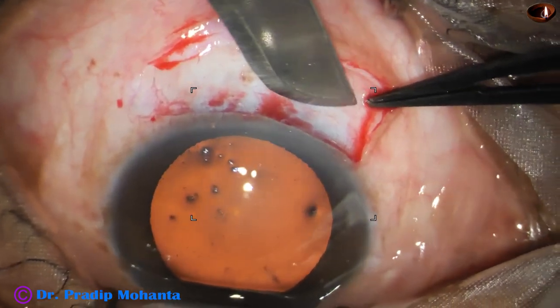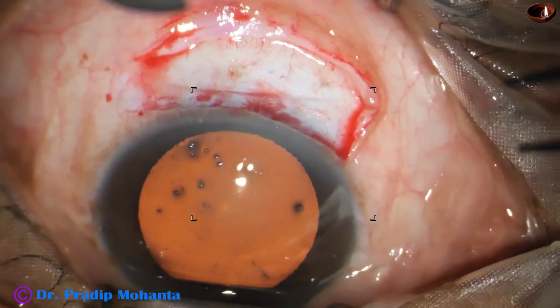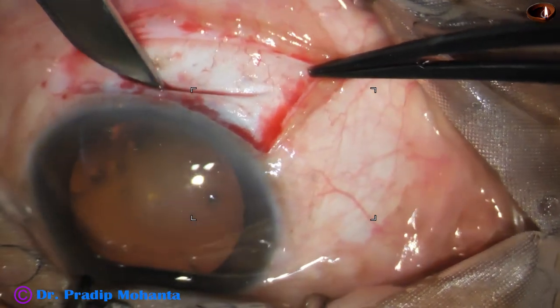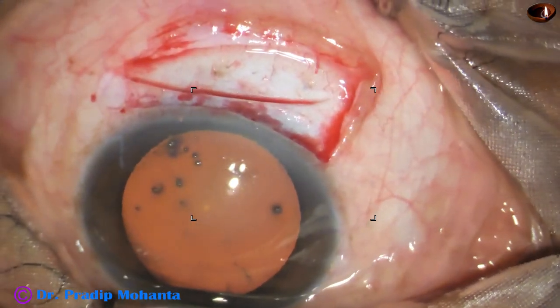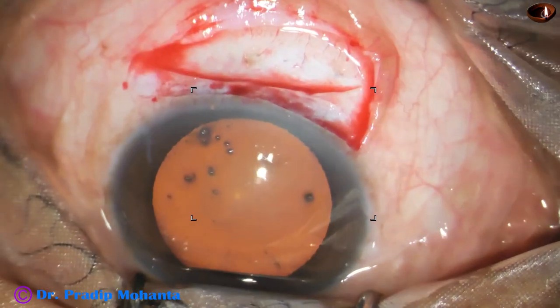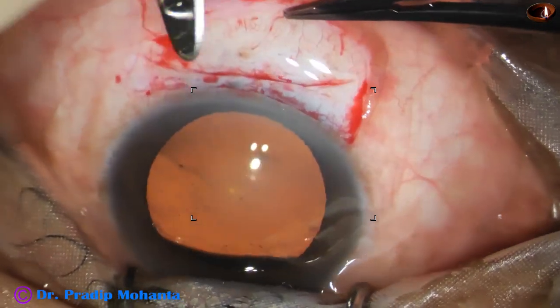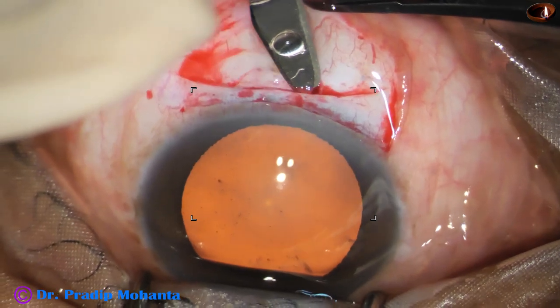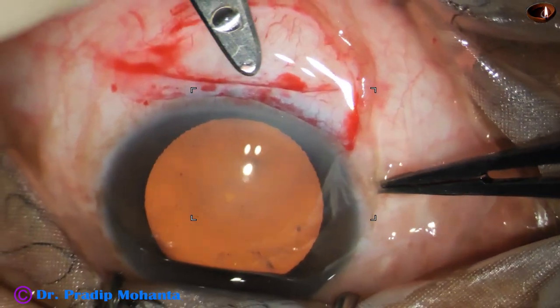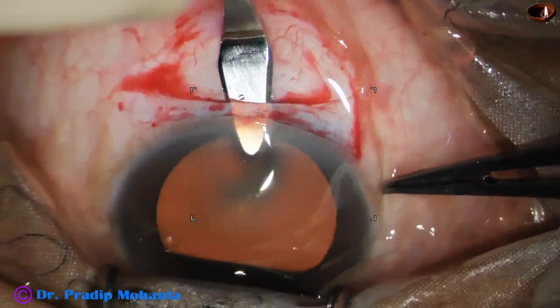Now making the sclerocorneal tunnel. This is going to be a mild frown incision along this path. This is almost half-thickness incision — you can use a guarded knife for this. Check the depth of the groove all around.